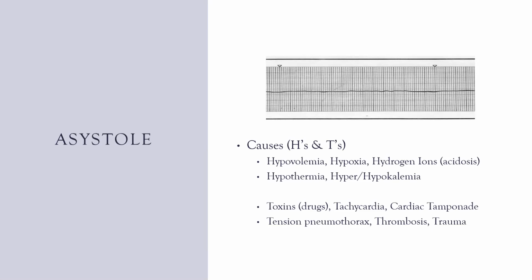Okay, the only other thing left to talk about, and I'm actually going to do something different for this one because it's heart blocks. Heart blocks are their own little beast. They have their own little difficulty in figuring out what's going on with them. Most of the time, your heart blocks are going to be characterized by a long PR interval. Hear me again. Your heart blocks are long PR intervals. Okay. If you have a patient with a long PR interval, it's going to be one of the heart blocks.